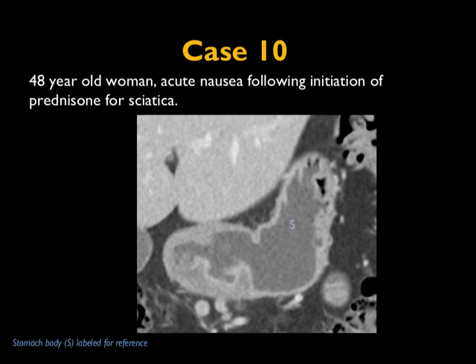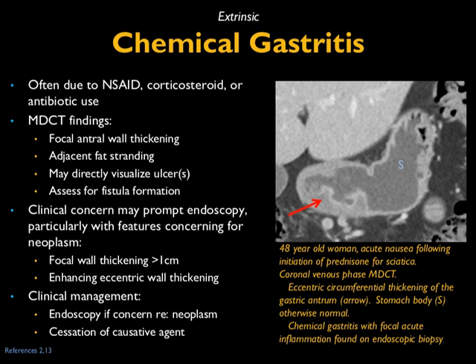Another case: patient with nausea following prednisone for sciatica. Drug-related processes are always something to consider when a new drug is started. This patient has diffuse thickening along the greater curvature with lobulations and enhancement — this was chemical gastritis, most commonly due to NSAIDs but can be due to corticosteroids or antibiotics. CT shows focal wall thickening, localized stranding, and perforated ulcers can occur. Because presentation is often severe, patients get endoscopy, which will show marked inflammation with chemical gastritis. Key management: keep the patient NPO and stop the causative agent.